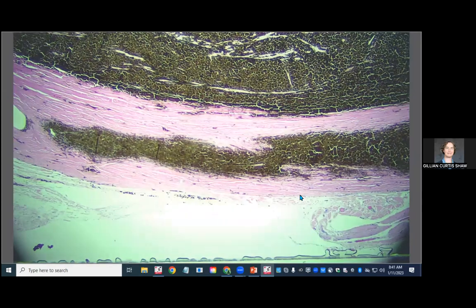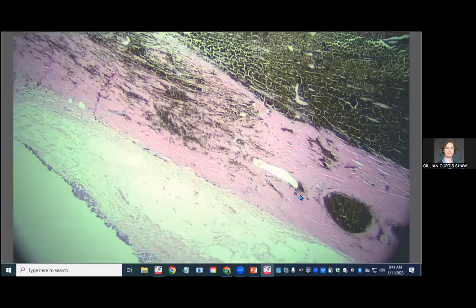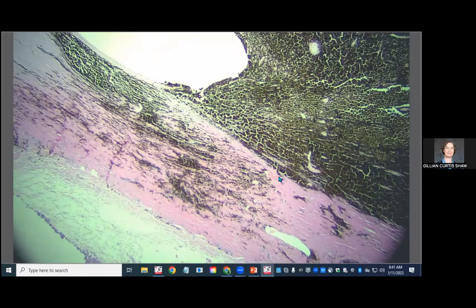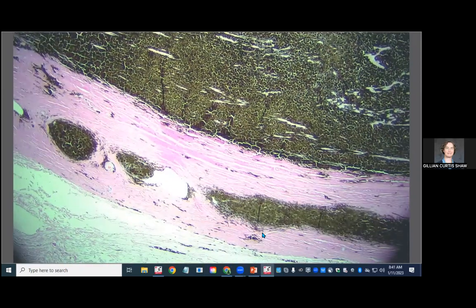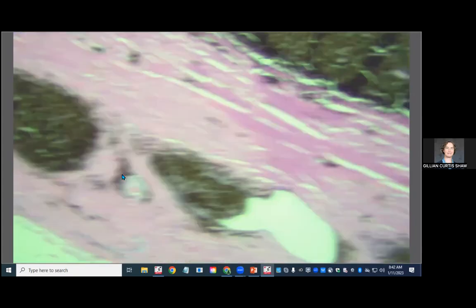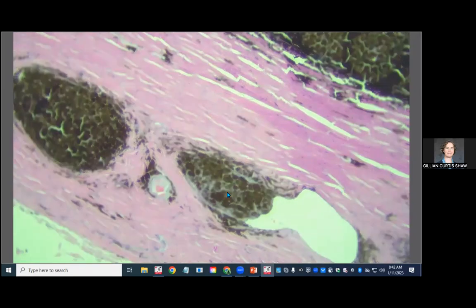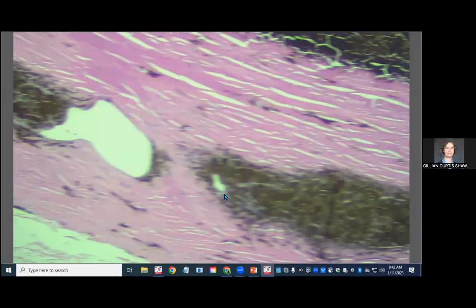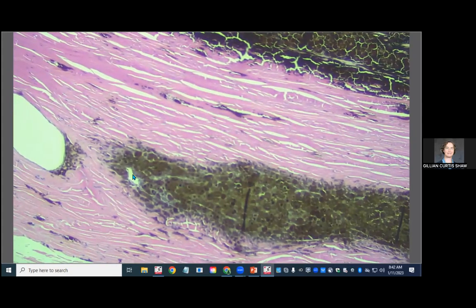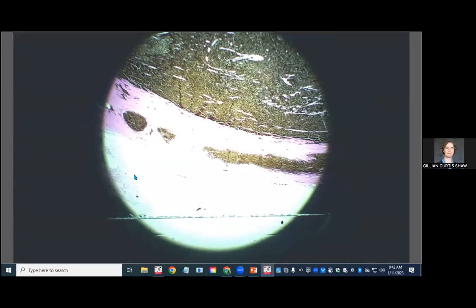In melanosis and heavily pigmented eyes, there are often melanocytic or melanin-containing cells out in the limbus and the limbal sclera, which is present here. And in this case, these cells are tracking along the veins of the scleral venous plexus, but they're not actually in the lumen of the venous plexus. They're just alongside it and squishing the lumen, which might also contribute to decreased aqueous humor outflow and glaucoma.